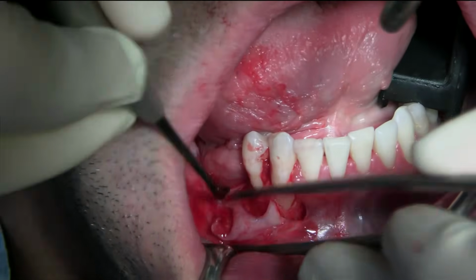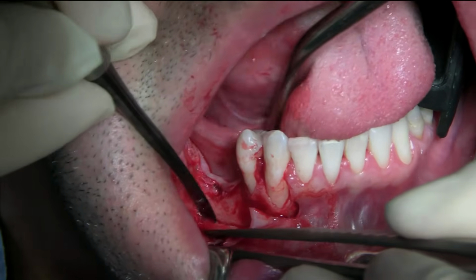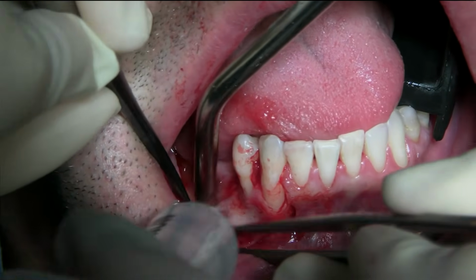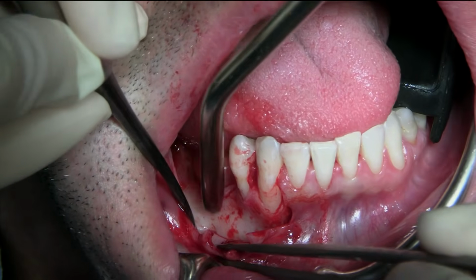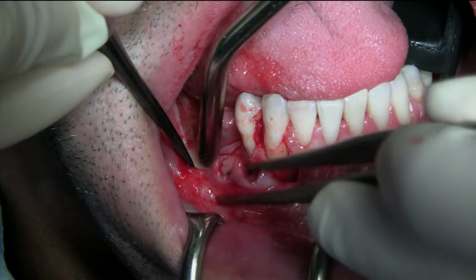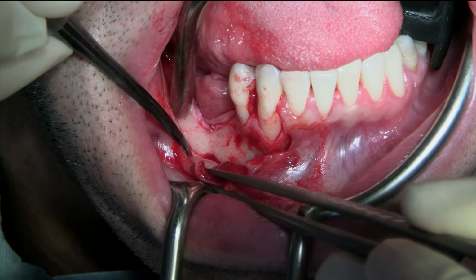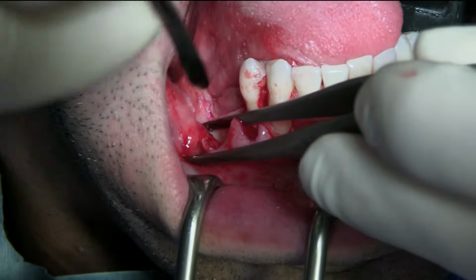This is my full thickness. Then here we're going to the vertical dip. The mental foramen is here. Yeah, I can see it right there, suction there. Can you see the mental foramen there? Right there. Yeah, that's the exit there. So right here in this area. So now I'm going to continue.